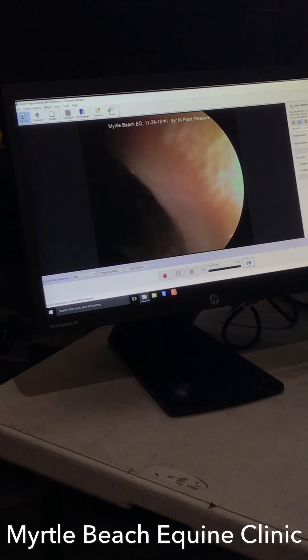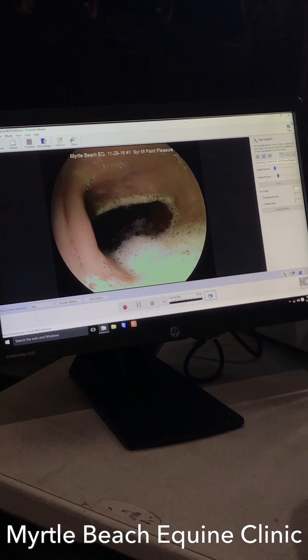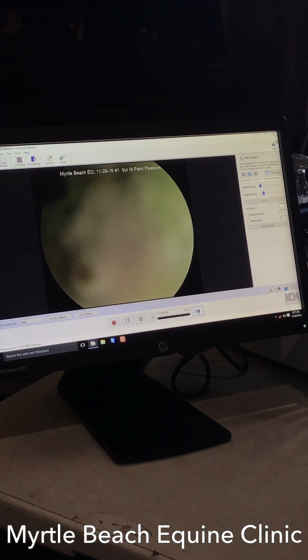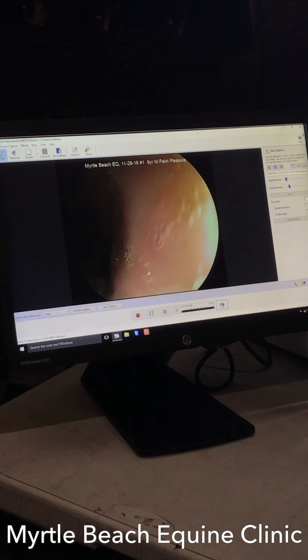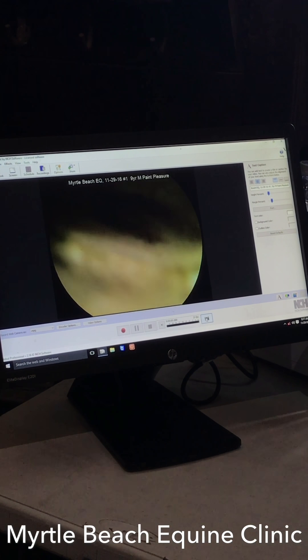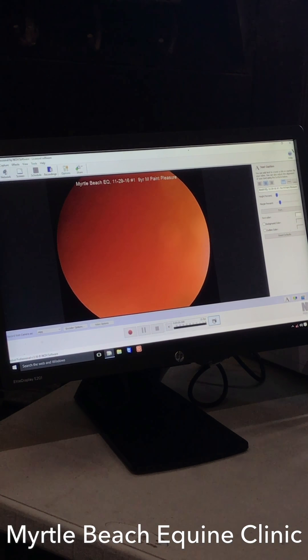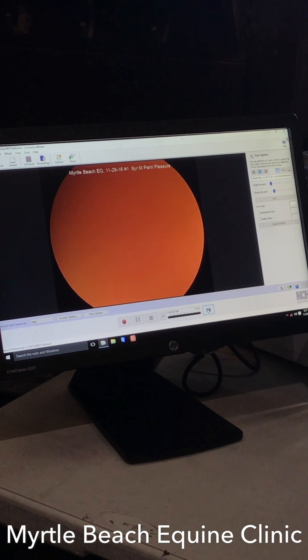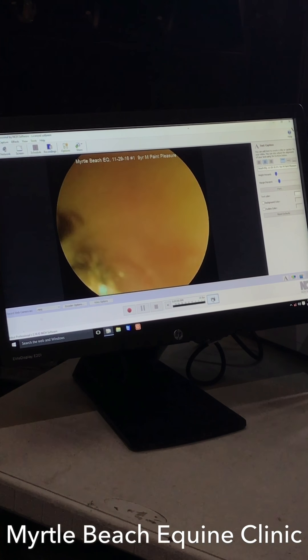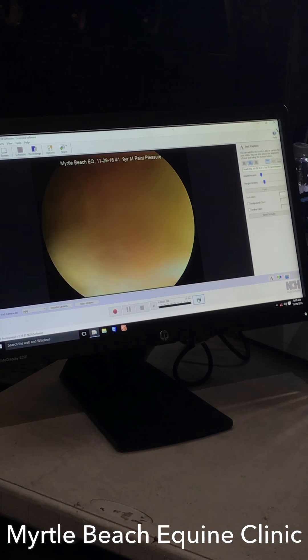We're just having a quick tour to see if there's anything in there, which there isn't. We're going to go ahead and come back. What's going to happen is you'll take all the slack out and it's not going to move for a while, but then when it moves it's going to move quite a bit. What we want to do is stop right inside the pylorus if we can and get a good look at that. Go ahead and withdraw — a little bit slower. We're getting all the slack out.